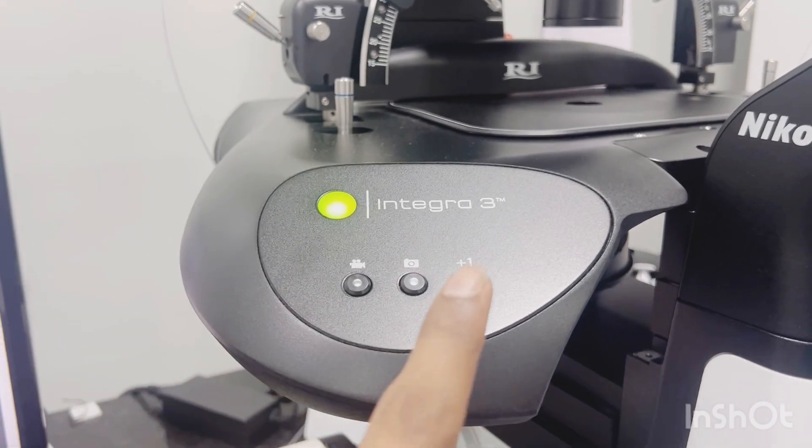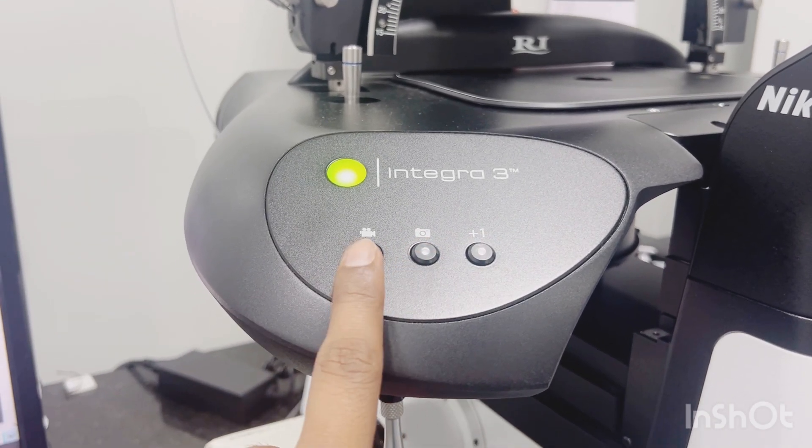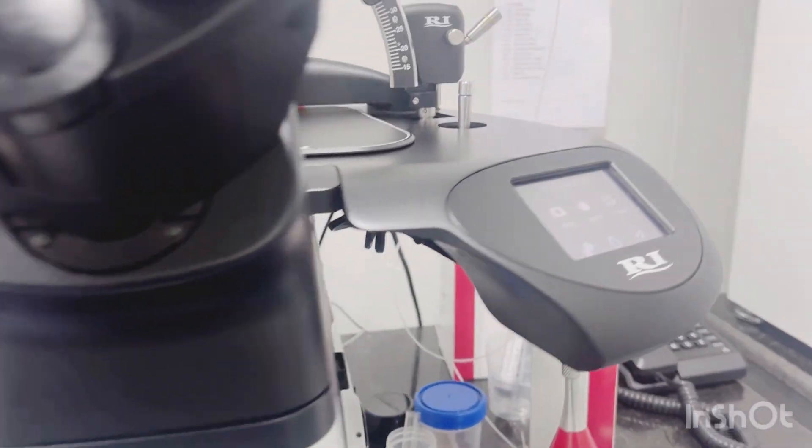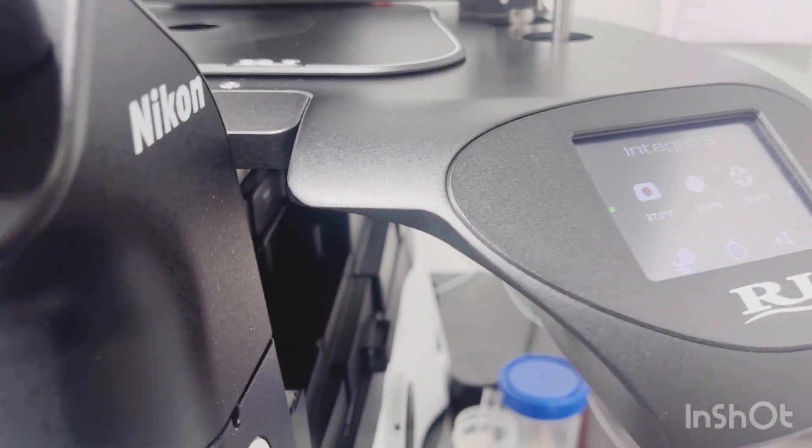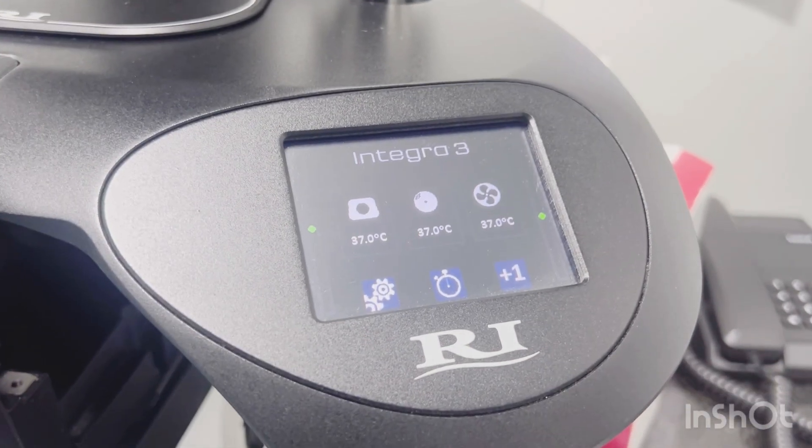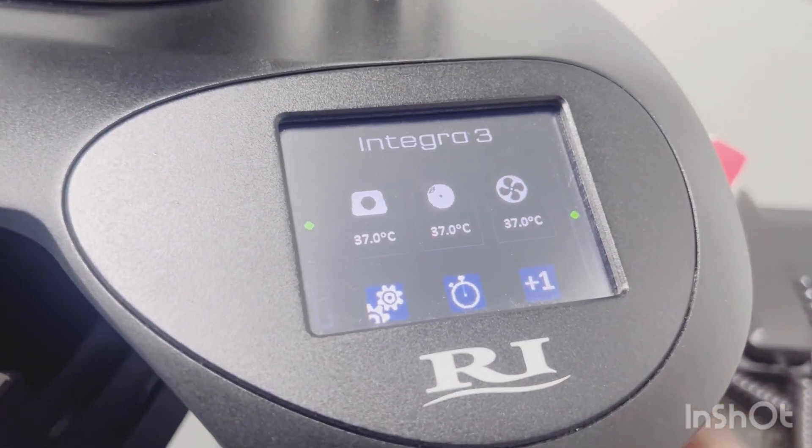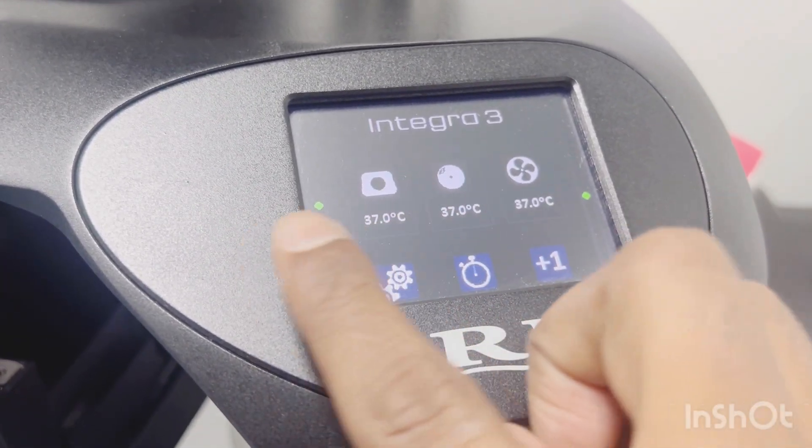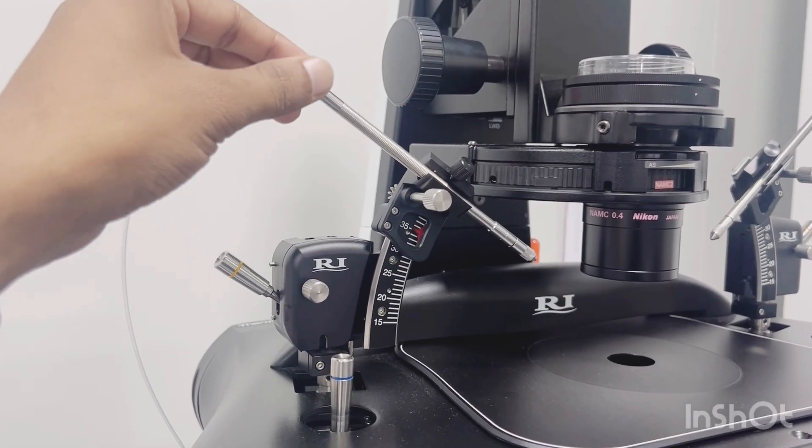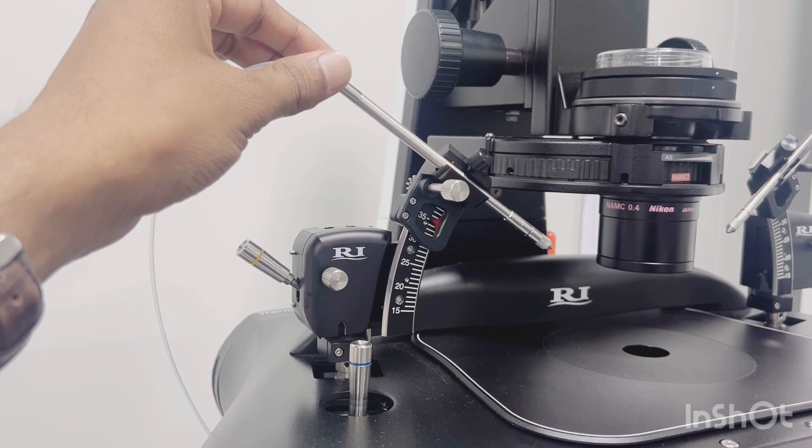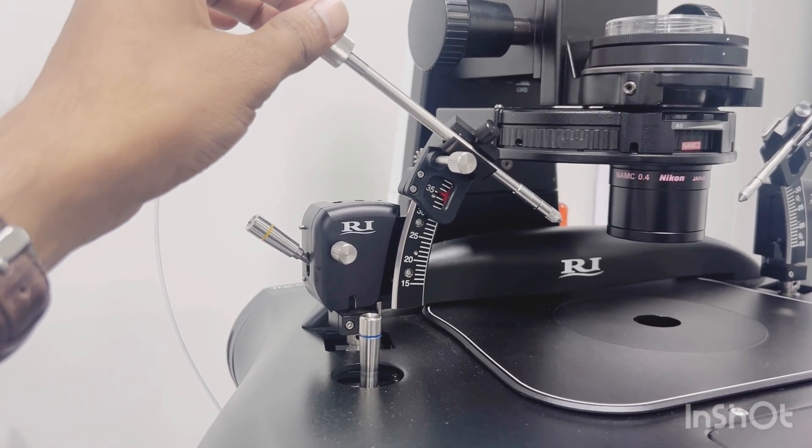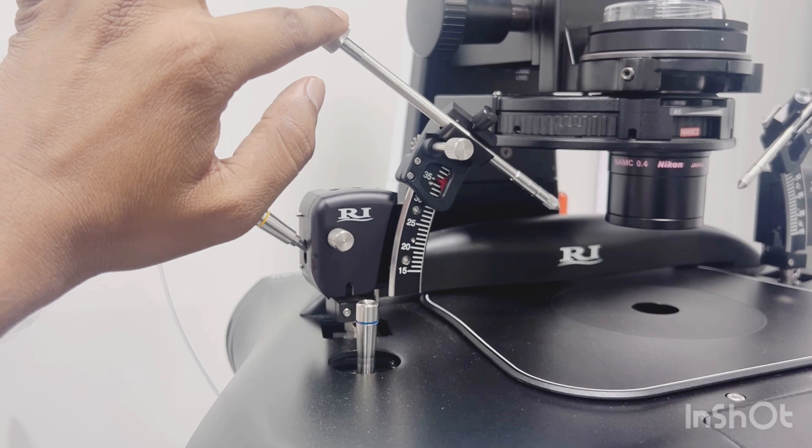This is the screenshot button, this is the video on/off button. This is the screen display which has green dots indicating the injecting and holding positions. This is the micropipette holder - we can rotate it toward front, left, and right.